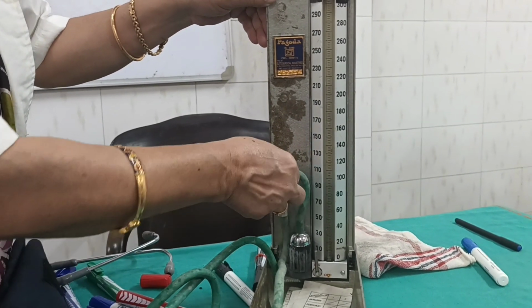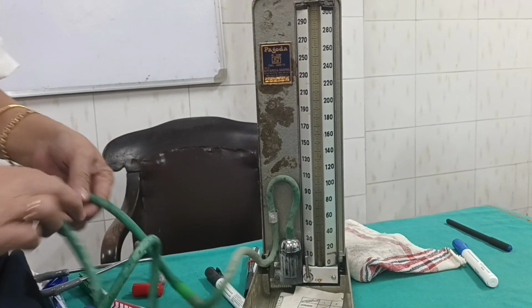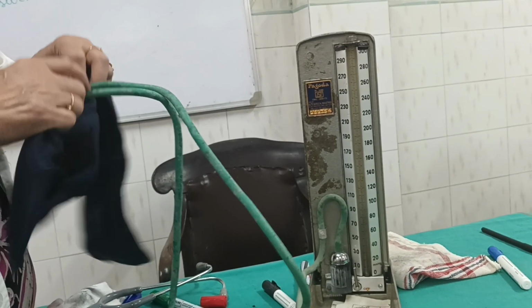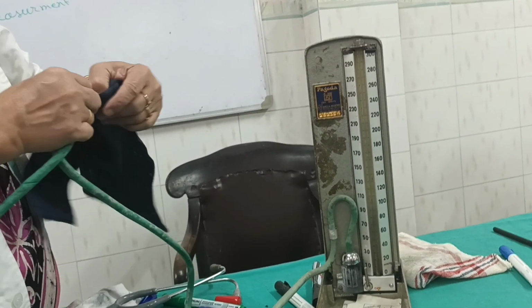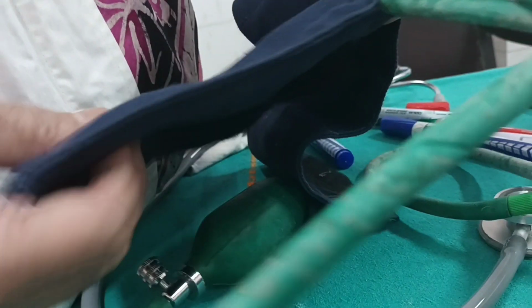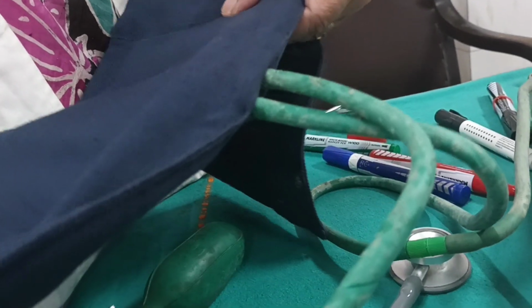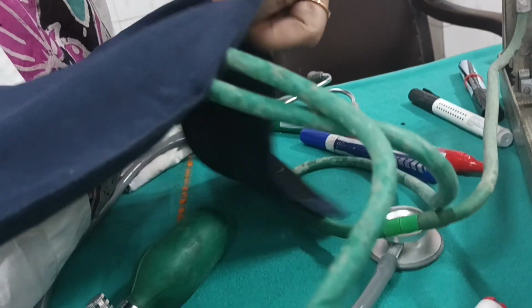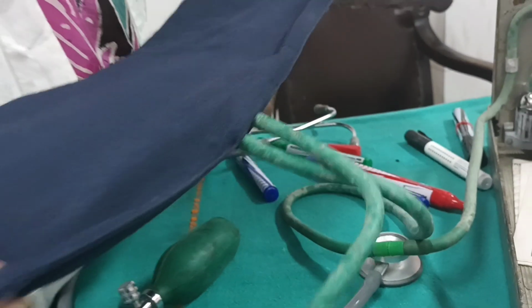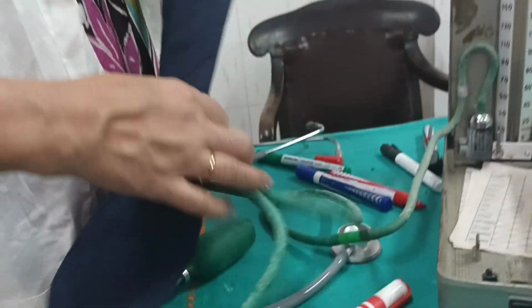Now, from the short limb, one tube is coming and this is attached to a cuff. This is called the Riva-Rocci cuff. See this rubber bag inside. It is enclosed in a cloth, and the rubber bag is up to this. You can palpate it and feel it. This is a rubber bag enclosed in a cloth with a velcro.